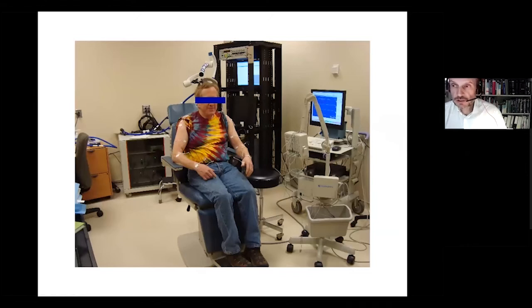Now, this is to illustrate, this was a patient participating in one of the therapeutic studies with Parkinson's disease. He chose the T-shirt. He was a very fine fellow. To show you, here we had the coil. We stimulated the motor cortex. We did offline analysis on what we call motor evoked potentials. So we studied several muscles. This is kind of a standard EMG recording, and we could do then off-record analysis.